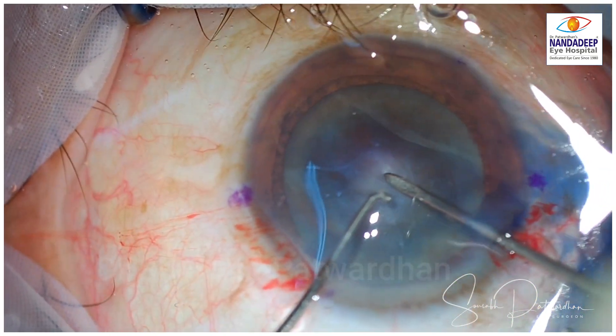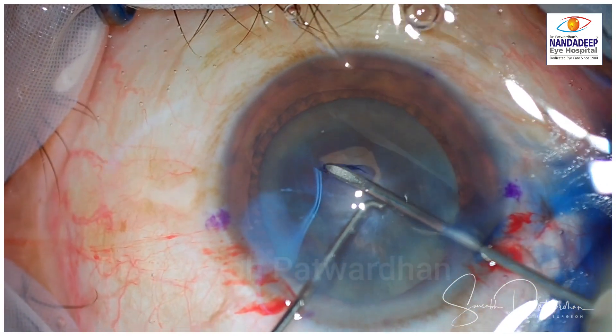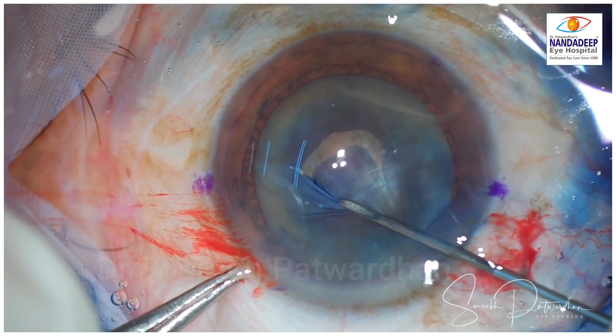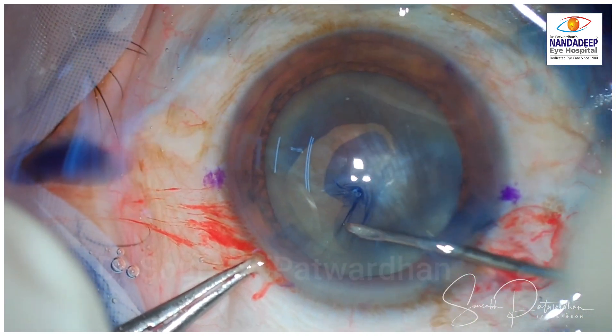This is a case of mature cataract, as you can see, and there is some amount of subcapsular fibrosis with an area of calcification. Luckily, it didn't cause any radial extension, and I could perform the CCC perfectly.